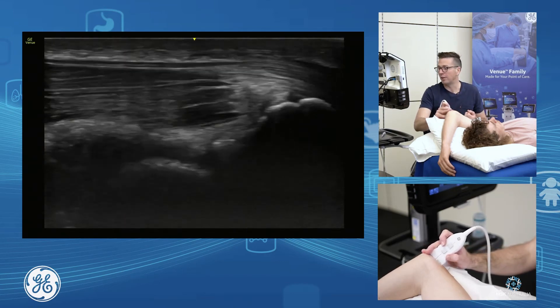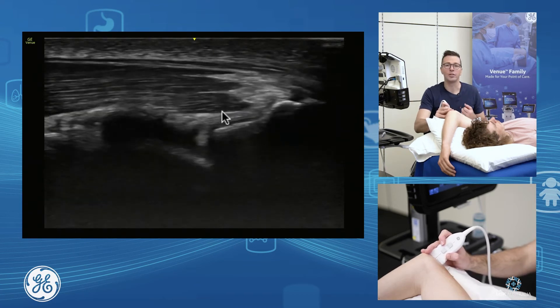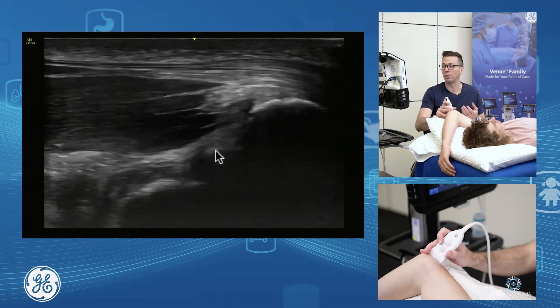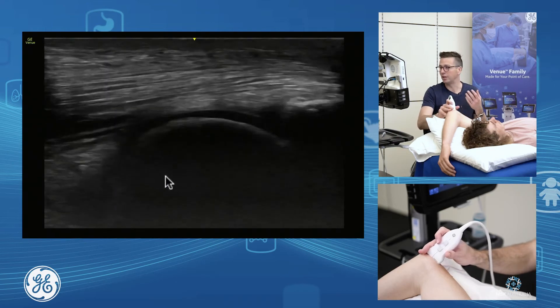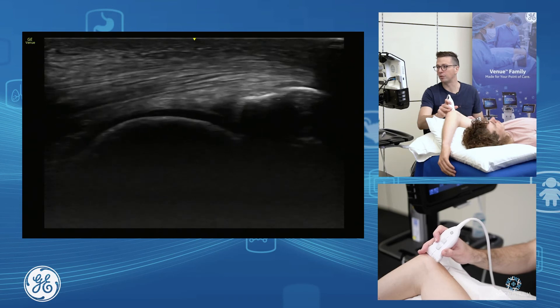Underneath our triceps in through here, we have the posterior aspect of the joint. We can assess what's happening in the back of the joint — this is a common place to get loose bodies. When people have issues with elbow extension, this is where we're going to be looking, assessing the posterior aspect of the joint.